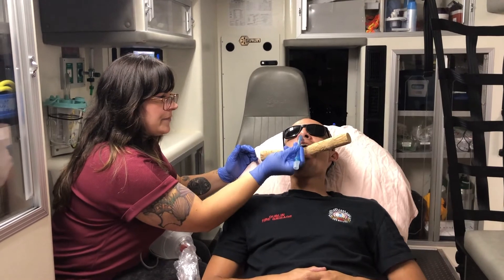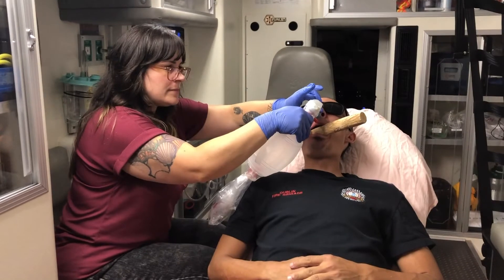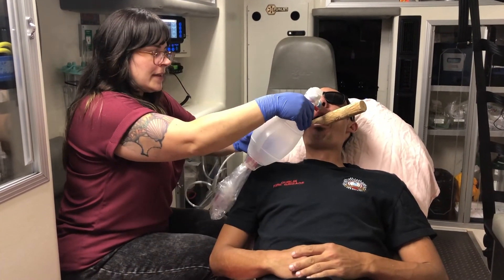You're going to come in here, attach the BVM to the end of the tube and ventilate.